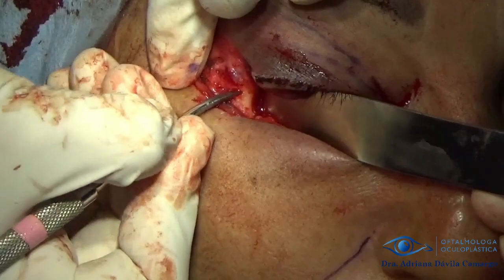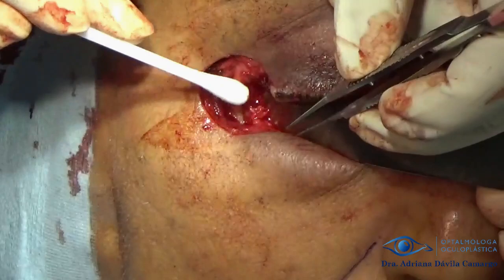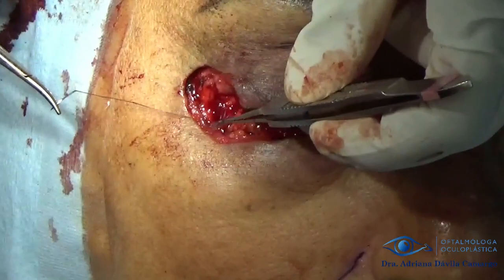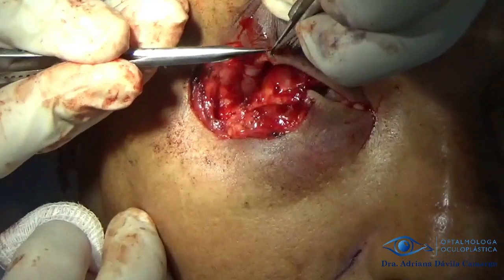We use the periosteum elevator to lift the periosteal flap or periosteal hammock. We proceed to release and suture the tarsus to the periosteum hammock at both the bottom and top. We then make a tarsus strip on the upper eyelid, dividing the lamella and removing the eyelid margin where the meibomian glands are to prevent the formation of epithelial cysts. The upper eyelid is sutured to the periosteum hammock with 5-0 prolene.